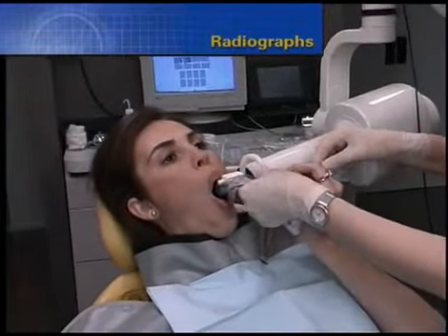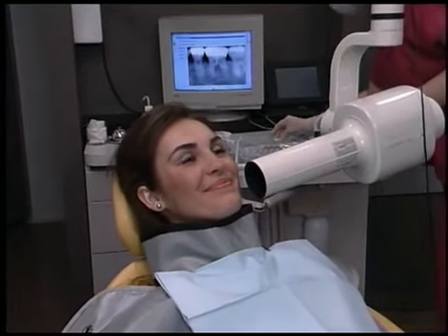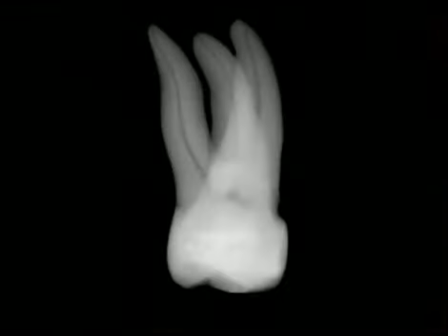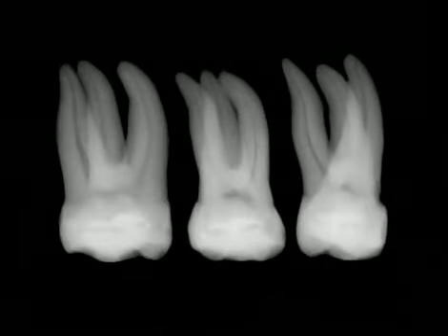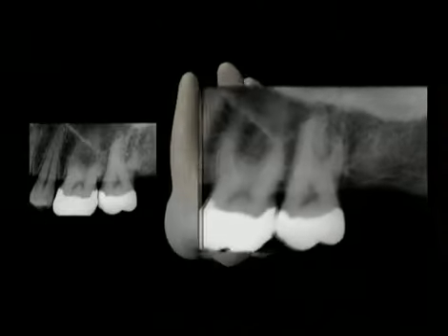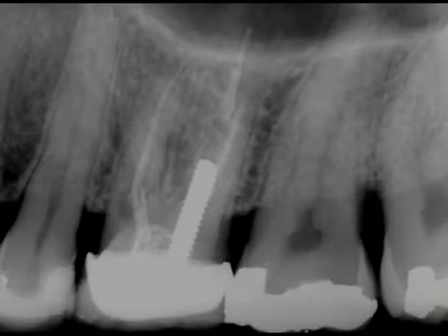Clinicians should take 3 well-angulated radiographs prior to initiating treatment in order to better appreciate the three-dimensionality of any given tooth. From an endodontic standpoint, preoperative film should include mesial, distal, and straight-on angles. These views will better prepare the clinician for root canal treatment. 3 films, in combination, are more valuable than a single film alone and give us important information as to the buccolingual dimensions of a tooth and root concavities.